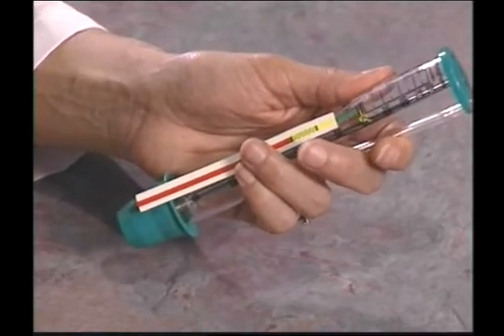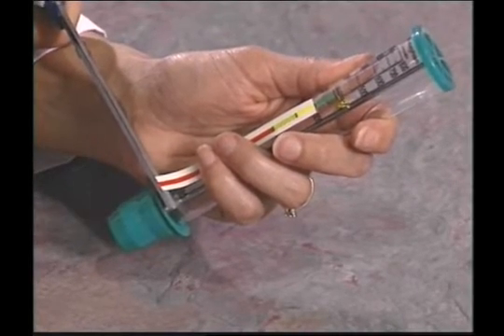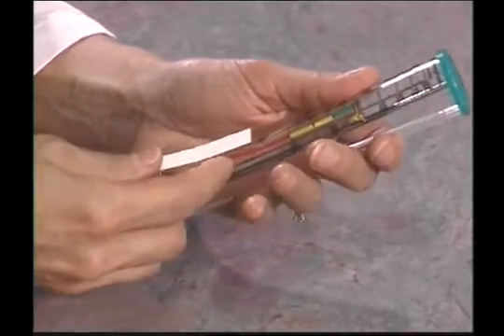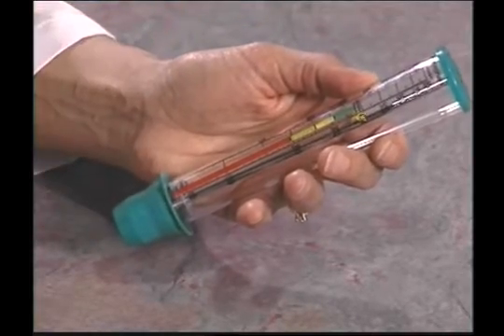They will press the green zone into place, then cut the excess red zone just above the reset diamond, and peeling off the remaining backing, press the color zone tape into place. Now they can do the same procedure on your daily diary page of the instruction booklet. TruZone Peak Flow Meter is designed to accurately measure peak expiratory flow.